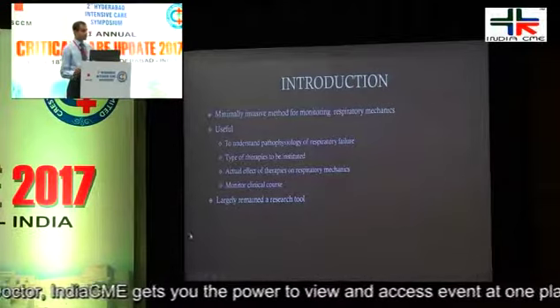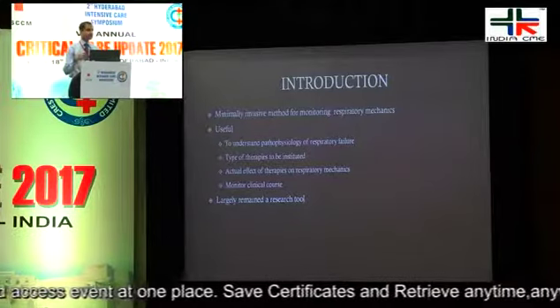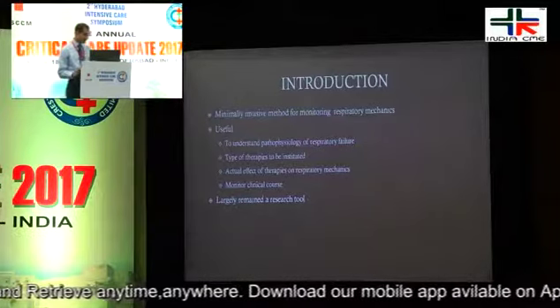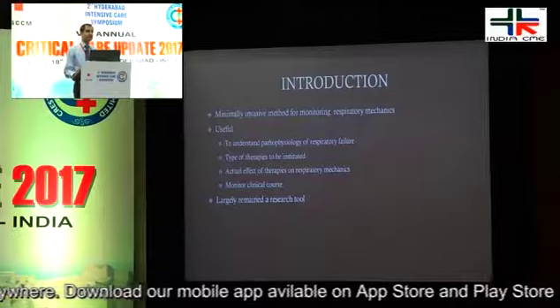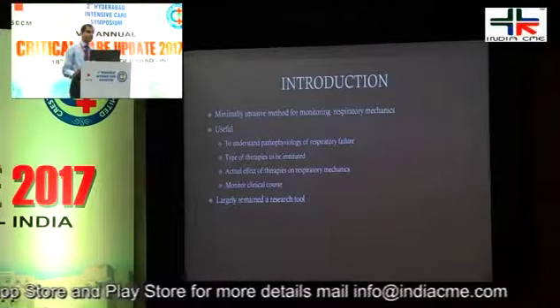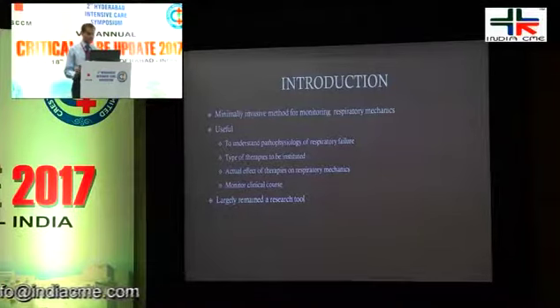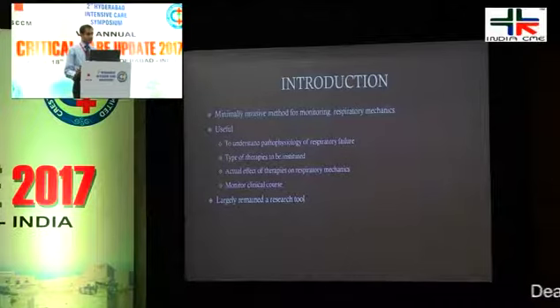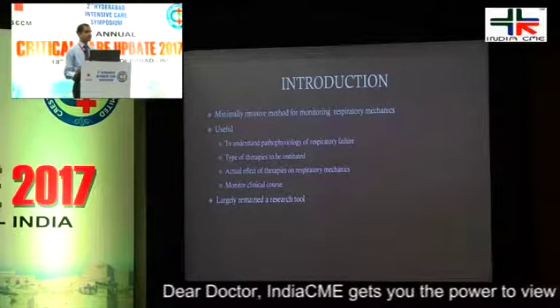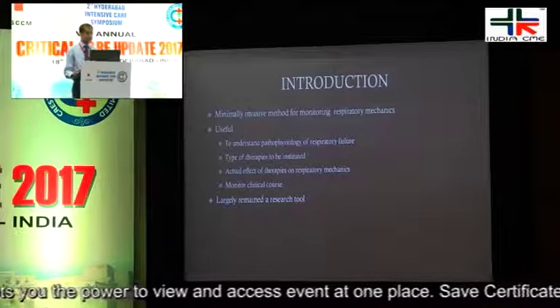Now, we talk a lot about respiratory mechanics in terms of very surrogate indices such as PEEP, plateau pressure, etc. But you should understand, as we all know, and probably have been hearing from the morning, that ARDS or many of these lung pathologies are heterogeneous diseases. It is not as we see in a textbook, where all the nice bilateral symmetrical shadows come in the X-ray, ultrasound, etc. It is not like that. We are quite aware of that. So the whole idea of using this is to see if we can be a little more specific in titrating different modalities of treatment or ventilatory support strategies that we have.